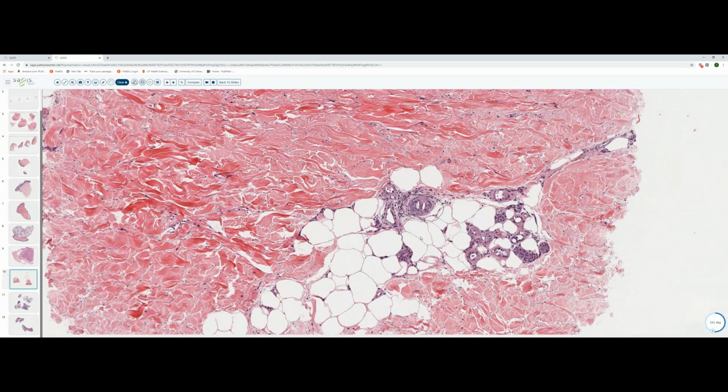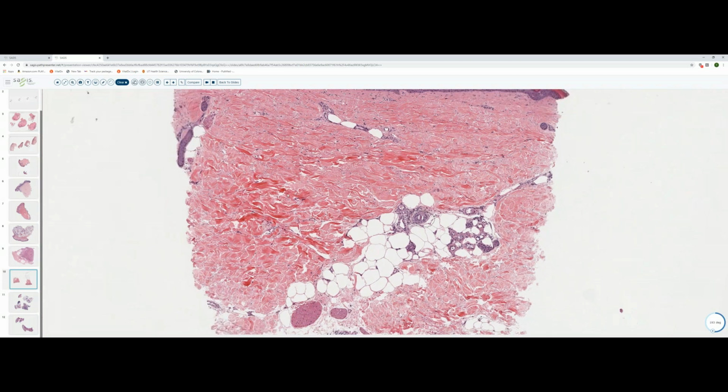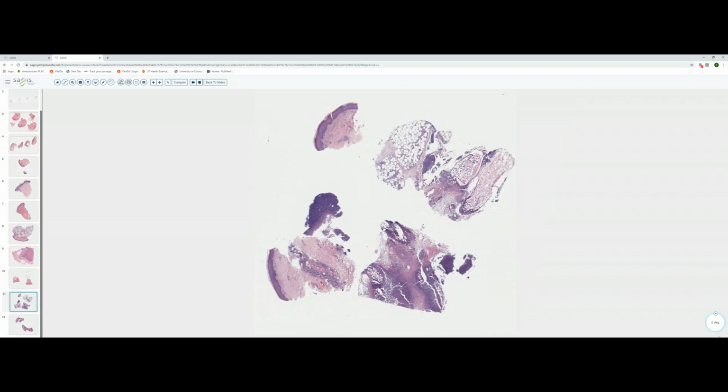Very, very subtle, but I thought I'd put kind of an equal number of super easy and more difficult slides on the test. That tends to be what they do on the boards. Most slides fall in the middle. If they give you 2 super easy slides, they're probably going to give you 2 equally difficult. That's just good test writing.